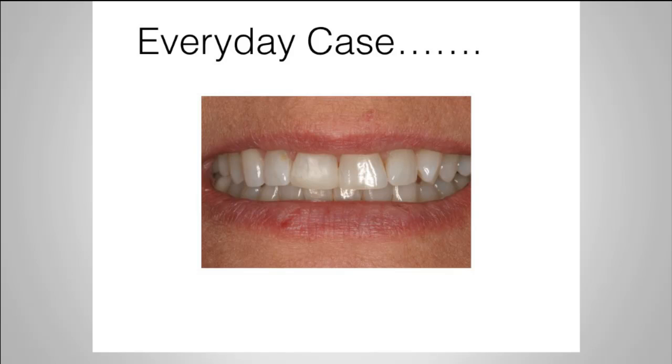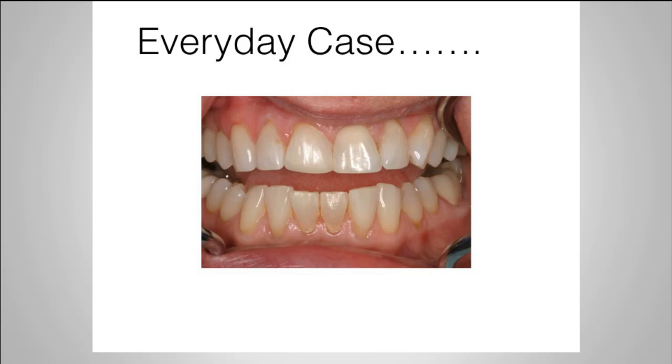You can kind of see the refractiveness to it a little bit as it blends right there, but the overall color blends halfway decent. After a polish, which is a really nice feature of this particular composite, I simply used a two-step polishing process in the Pro Gloss system by Kerr, and it was able to really establish a quick, easy shine. Did not take me a long period of time.